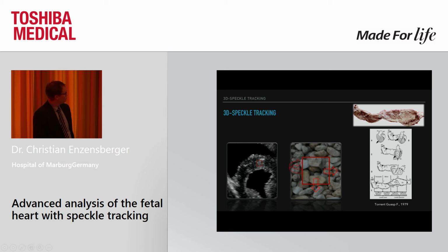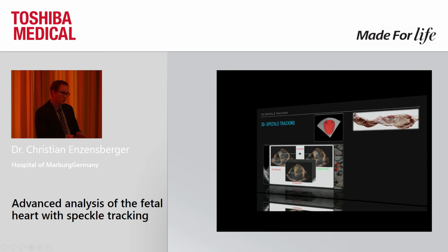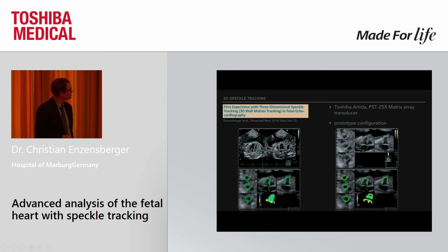Therefore, we dealt with 3D speckle tracking, in which you do not have only one two-dimensional plane, but a pyramidal volume in which all the vectors can be calculated. Just to show you a few slides, we already published this in 2014.